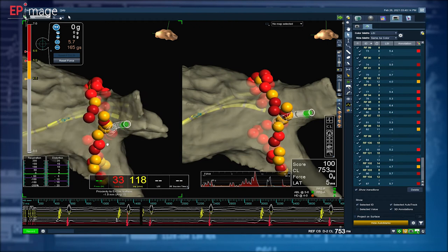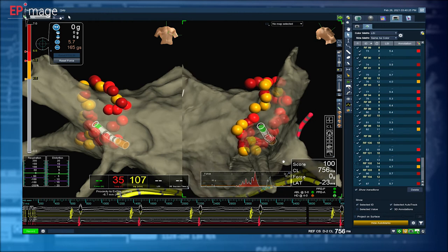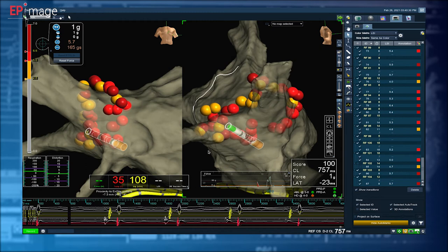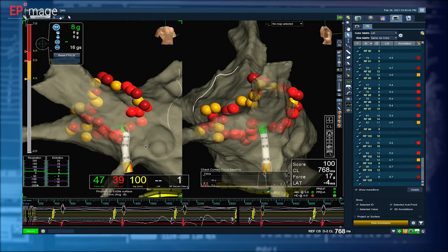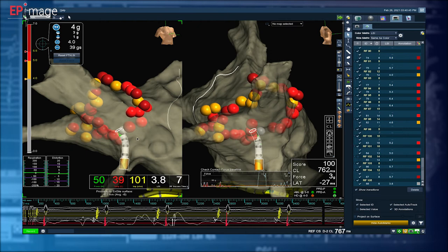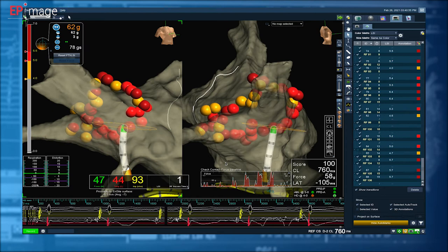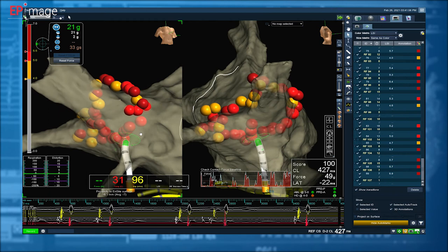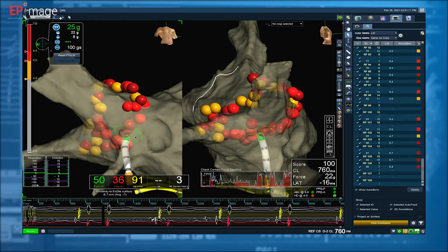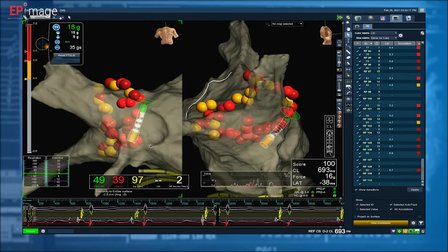So we are just finishing the isolation of right pulmonary veins. There are still some gaps on the anterior septal region, so we'll go there. Now the recording is not accelerated anymore, so it's a real-time application, and you see that the application is quite fast, just a few seconds, depending on our contact. Okay, so we're closing any gaps we can see. We are very close to the region where we performed the transseptal puncture, so we have to be quite delicate and not dislodge the catheter into the right atrium.